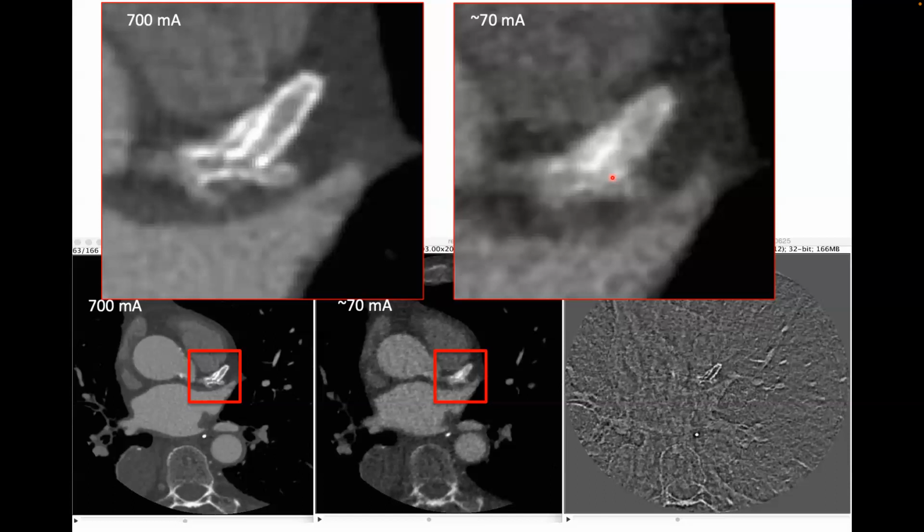Because I was wondering if they have access to some special kind of detectors that scale? No, I think it's just the geometry of the scanner. Most of the technology is off the shelf usually, right?